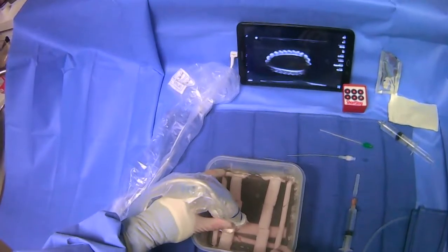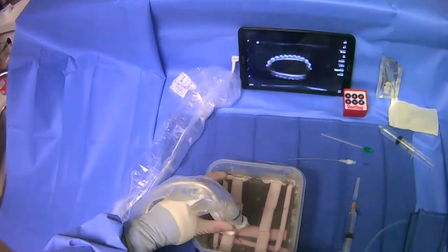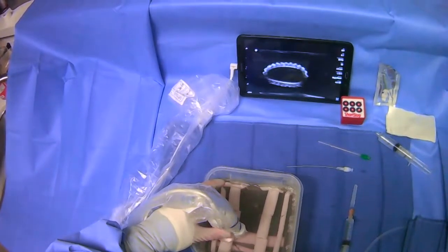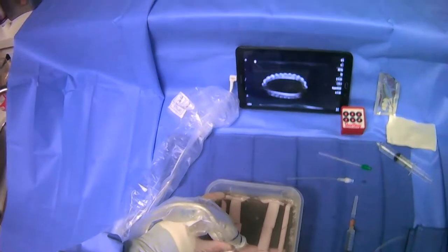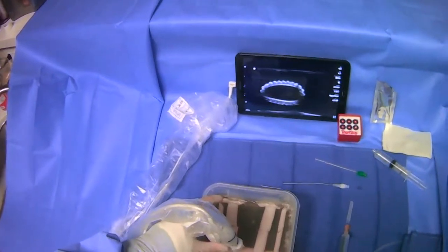This video is going to go over how to anesthetize prior to an internal jugular vein puncture. The video presumes that you've already made a skin wheel and a dermatotomy and that you're ready to anesthetize the track deeper.